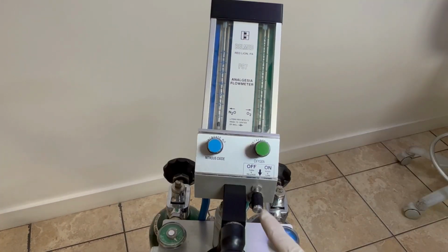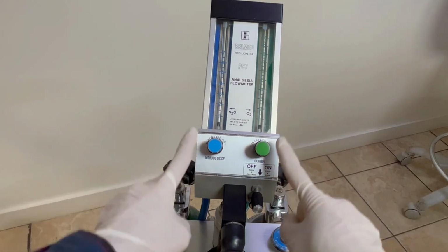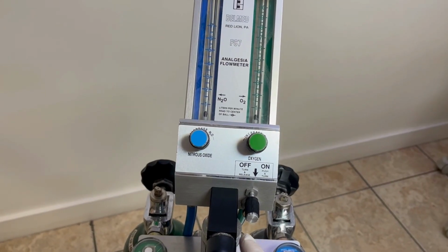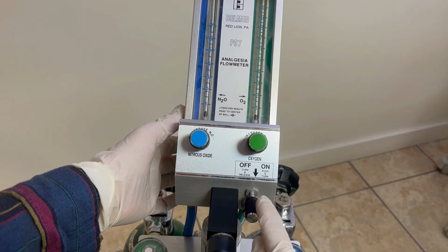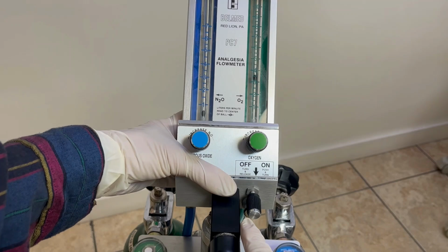Now let's turn on this main switch that controls the airflow in the meters. Push in and turn clockwise until it stays there. Okay, now that's it.